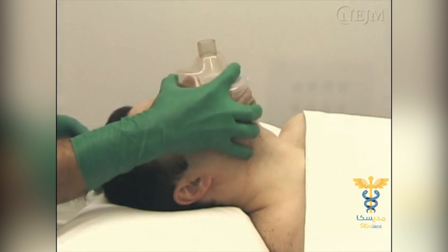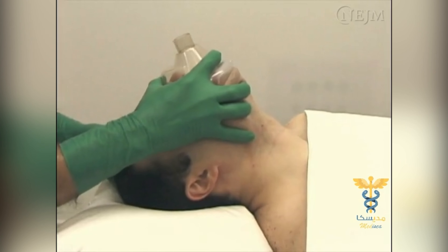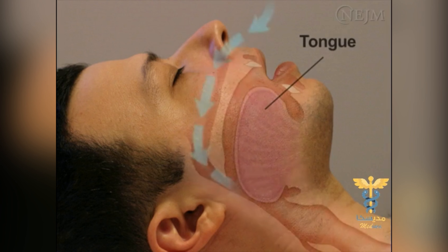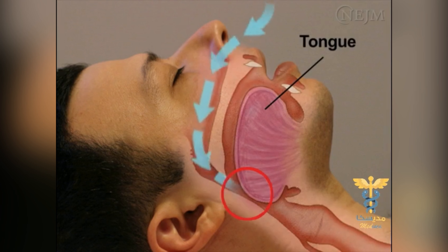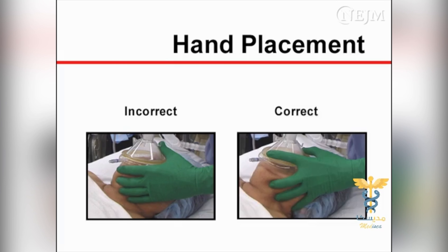There are a variety of bag valve designs available. All have a self-inflating bag and a non-rebreathing unidirectional valve. The valve is designed to function during both spontaneous and manually controlled ventilation. Because bag valve devices can operate without an oxygen source, it is important to ascertain that supplemental oxygen is flowing through the bag valve device when indicated and available. Bag valve devices can be equipped with an oxygen reservoir of varying design. If the reservoir bag fills, oxygen is flowing. Oxygen flow through bag valve devices with a tube reservoir can be confirmed by listening to the sound of gas flowing.